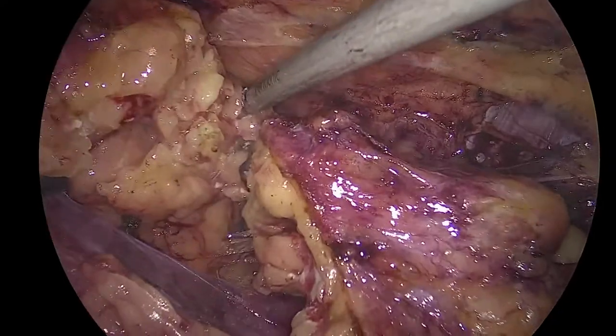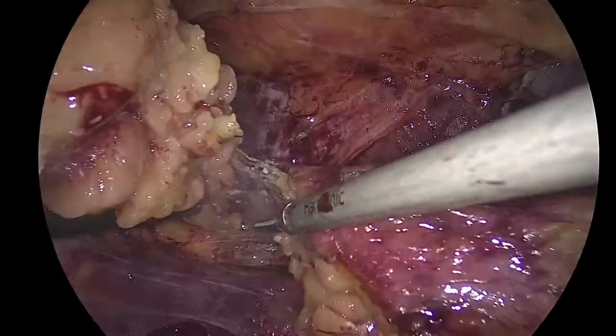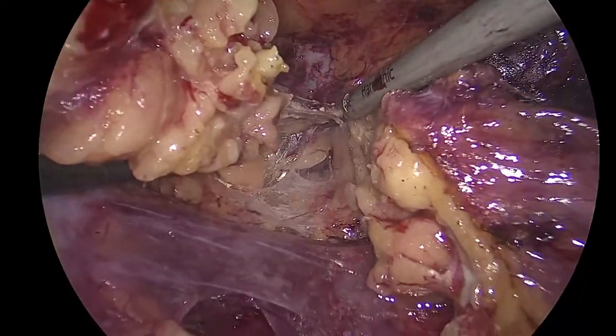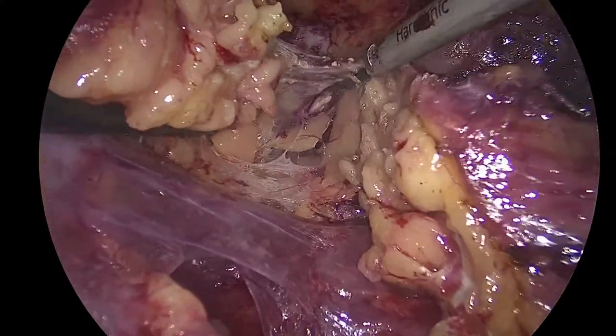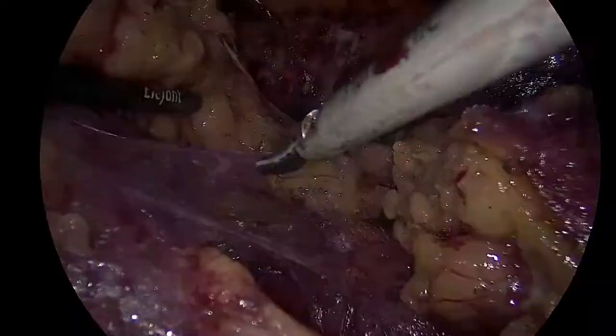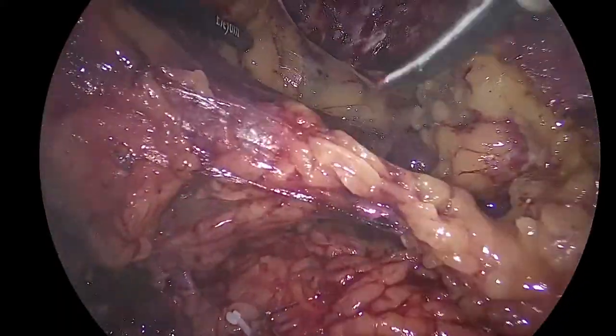The fat tissue looks a little bit toxic, isn't it? We will see. I hope it's not toxic, because it can become a disaster when you're trying to find it. But I don't think it really is. We will see on the kidney. See how important this is, your vision back. This is excellent. Show me the ureter again. Dissection is good.